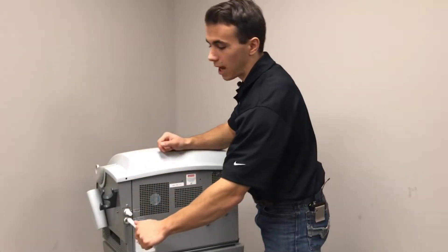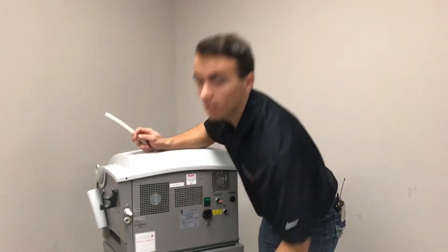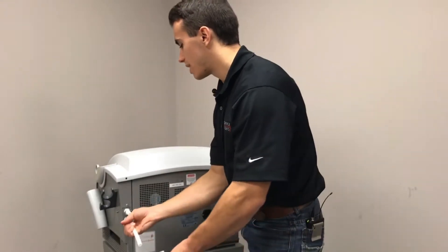Get your drainage tube and connect it to the bottom fitting here labeled fill drain. Make sure you have your empty container ready to go because water is going to come out as soon as you attach it.